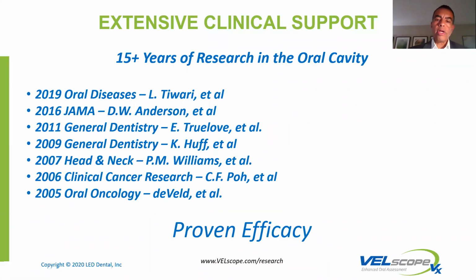So for your information, in case you have that 1 in 1,000 patients that needs clinical evidence to support it, go to our website. There are 30 plus studies based on 15 plus years associated with fluorescence and the efficacy and the proven ability to identify precancerous, cancerous lesions that obviously could be life-threatening.